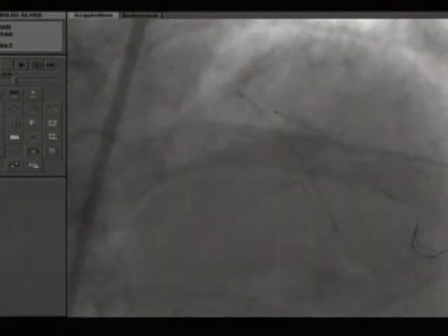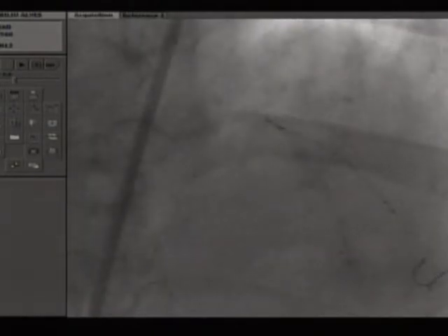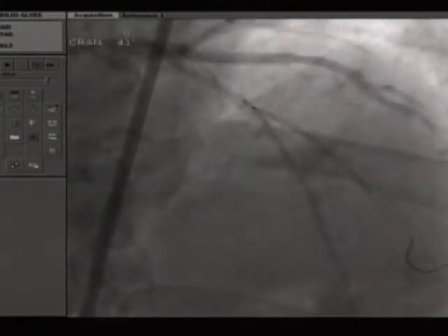Miguel. I think it's important in my practice to use 7 French guide catheters for two stents or 2 balloons. It's more safe. It's very annoying when you stay trapped within a guiding catheter. With 2 stents you cannot maneuver. And we have used 7 French even through radial access without greater difficulty. Great. In the majority of patients you can use 7 French through radial. So Expedito, now you're at a crucial time. You have 2 long stents, so tell us what you're going to do now.